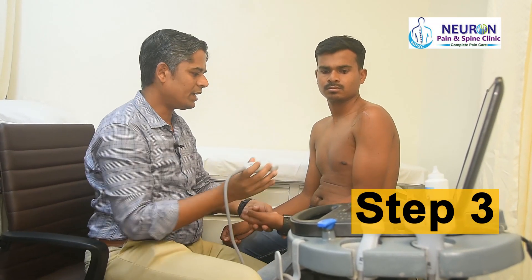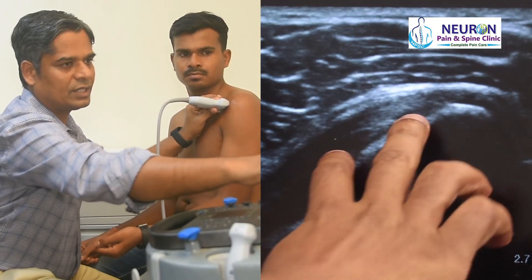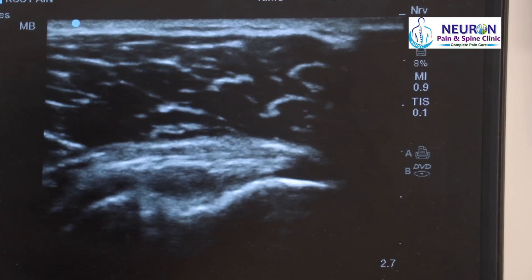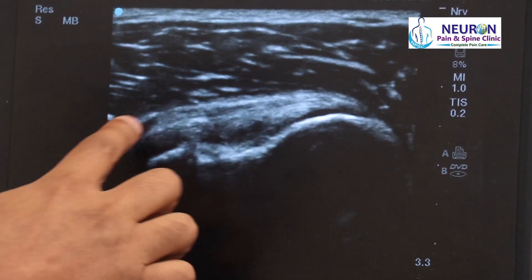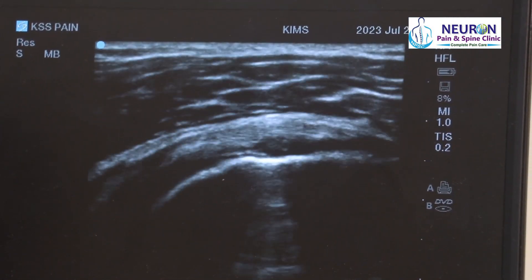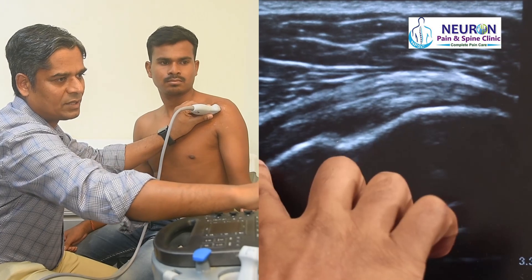Step three: from that position, I move my probe slightly medial to scan the long axis of the subscapularis tendon. That is the lesser tuberosity and this is the subscapularis tendon. Ultrasound allows dynamic assessment — I tell the model to slowly abduct. One can see that is the footprint, the area where the tendon is inserting. This is the fibrillar appearance of the subscapularis tendon.